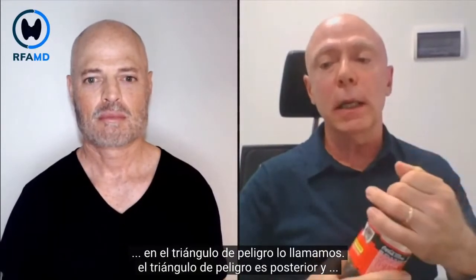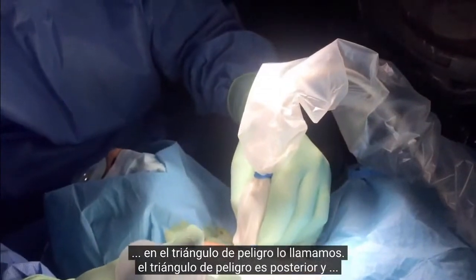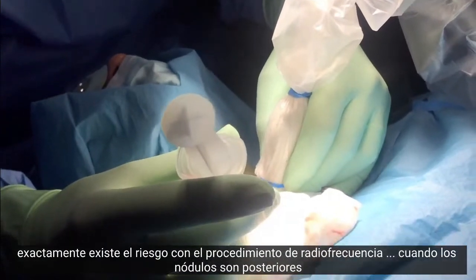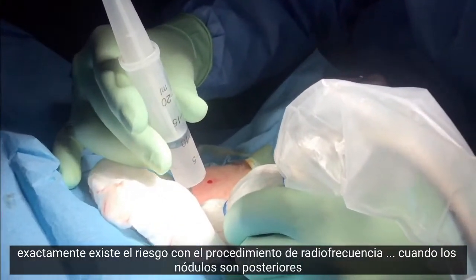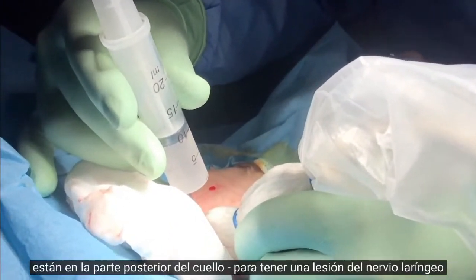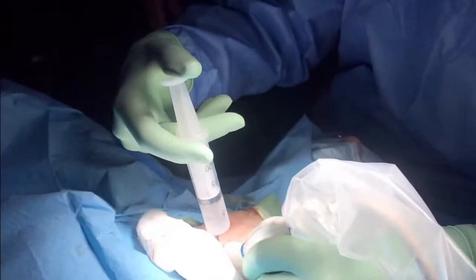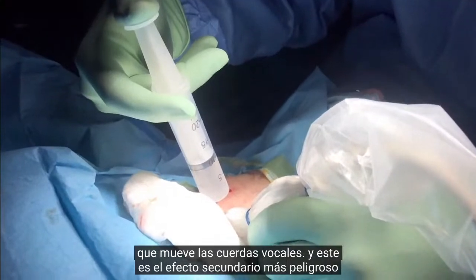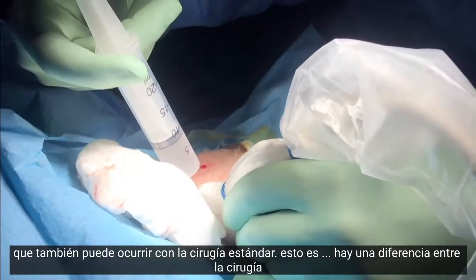Laryngeal nerve is in the danger triangle. We call it the danger triangle. It is posterior, and exactly there is the risk with radiofrequency procedure when nodules are posterior, in the back of the neck, to have injury of the laryngeal nerve, which moves the vocal cord. And this is the most dangerous side effect, which can occur with standard surgery as well.